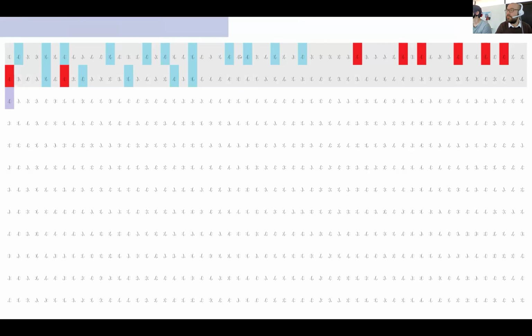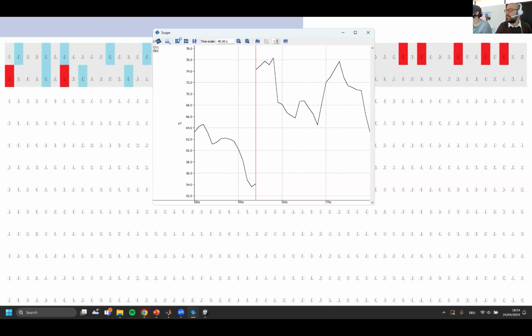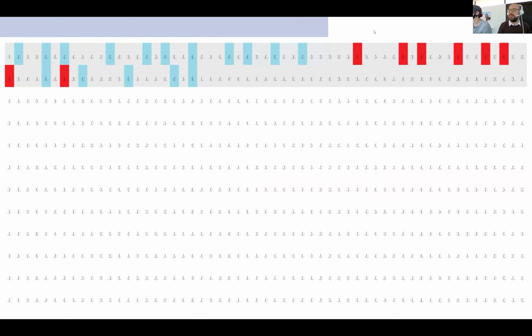I'll stop again and see the reaction. So you can see while they were doing the cognitive task, the results were much better. And now that we stopped, it's getting lower and lower. So it really fits to what they are trying to do. I'll ask MJ to restart again. Then we see if there is a raise on the feedback in real time.